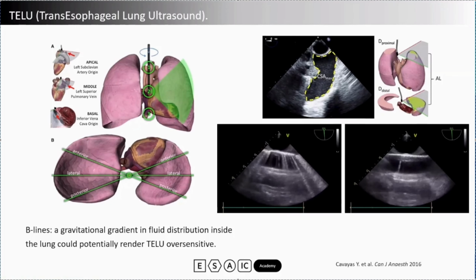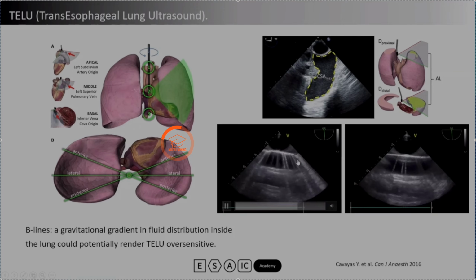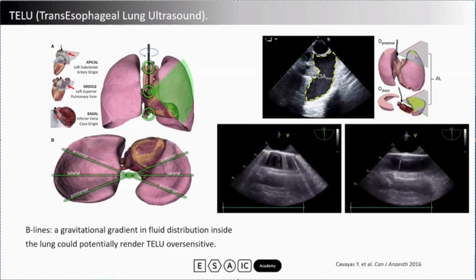Of course, not in this kind of detail as in transthoracic lung ultrasound, but it's also easy to detect collections, pleural fluids, but also, as you can see here on the two videos on the right below, you can see a lot of B lines before recruitment, and after the recruitment you see the almost complete disappearance of these B lines.